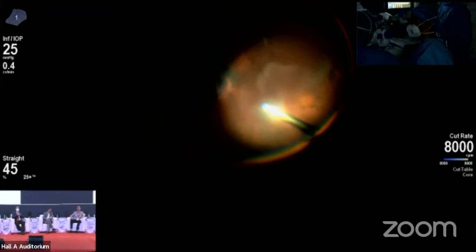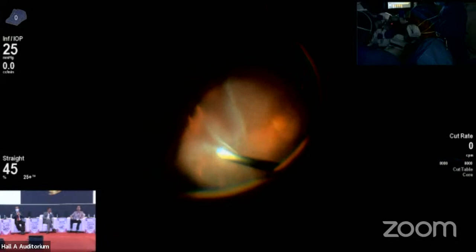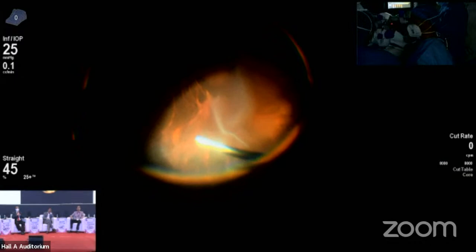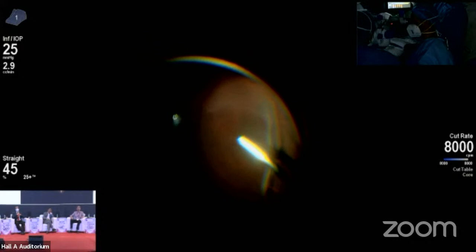Yes, sir. So you can see, the moment I came to the area of detached retina, the retina started to flutter. So I have lifted my foot pedal a bit so that vacuum is lesser. So as of now, it is around 230. So that is a very important thing youngsters must take care of when they are doing vitrectomy, especially in the area.